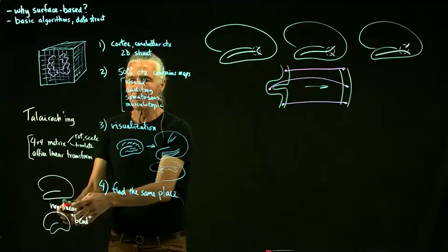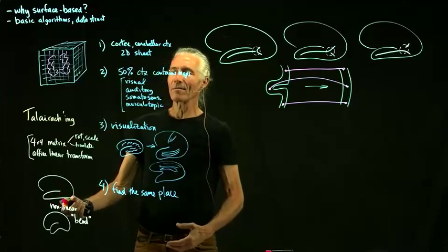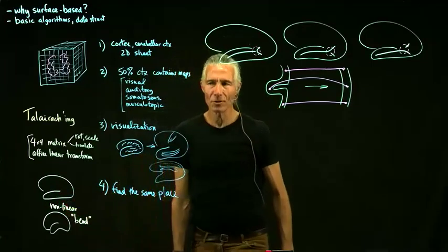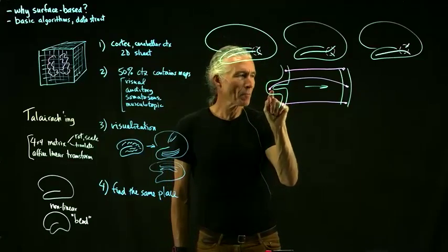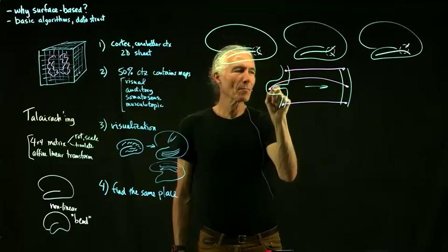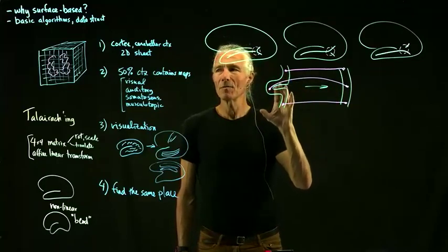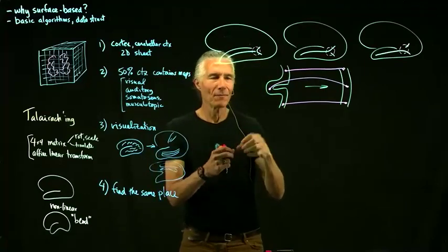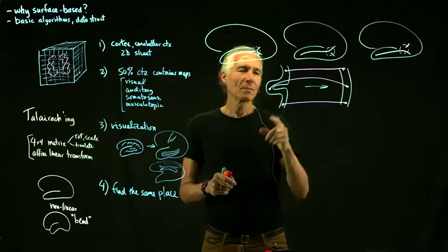Of course you can't do that with a linear transformation, but you could do a more complicated nonlinear transformation in 3D. But the problem is it's hard to control, because you've got to move this position that was in the sulcus in one brain a large distance, but the parts of the brain that are nearby are not going to move hardly at all. So you've got to kind of turn the brain into taffy in order to do that in 3D, and it's pretty hard to control.